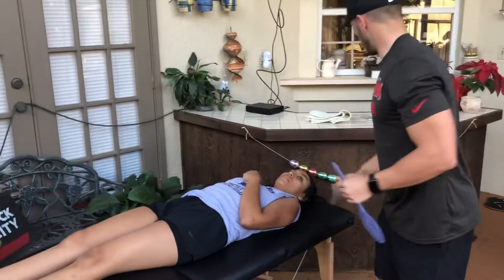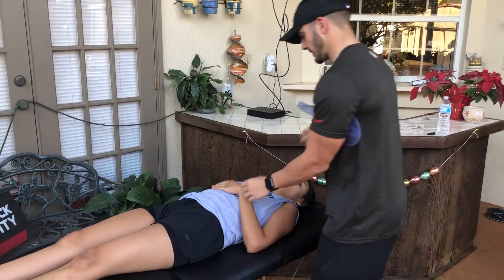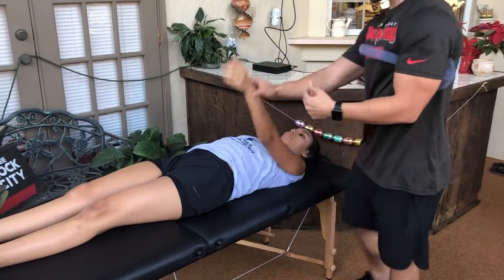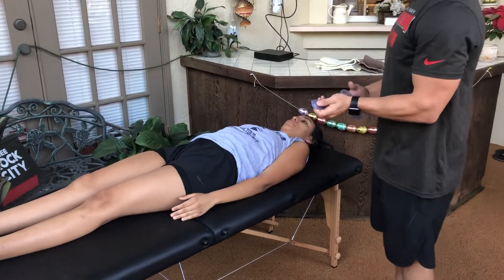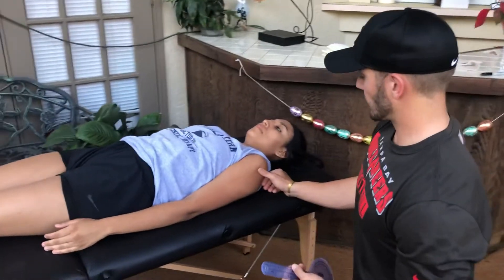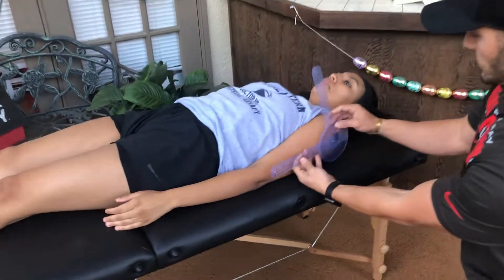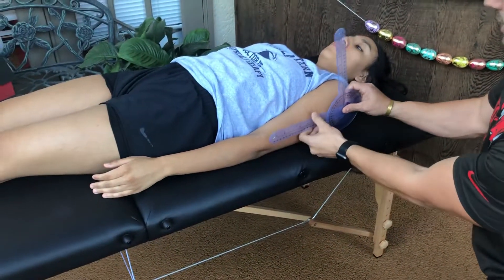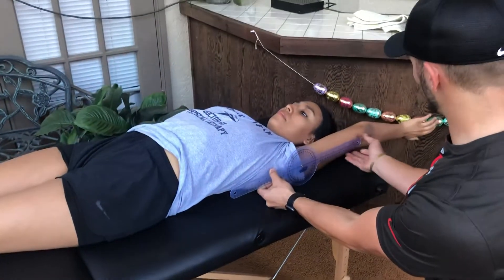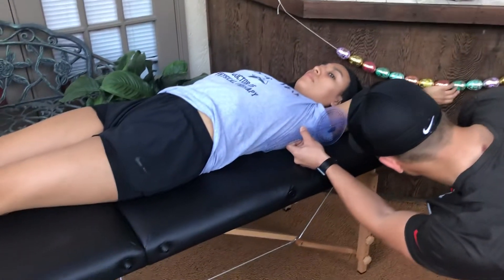Next, we will do shoulder flexion — I'll show you the movement. It's going to be like this, all the way up overhead. My axis of rotation for this is going to be out here on the greater tubercle. The stationary arm is going to follow the mid-axillary line. Go ahead — overhead. And my moving arm is going to go to the lateral epicondyle. I have 180 degrees.